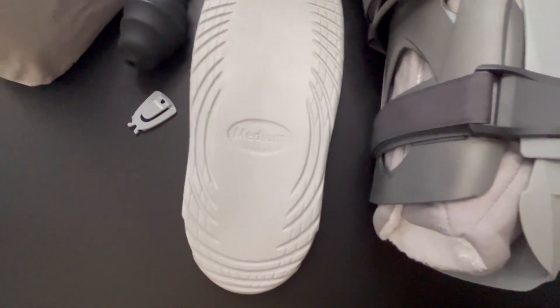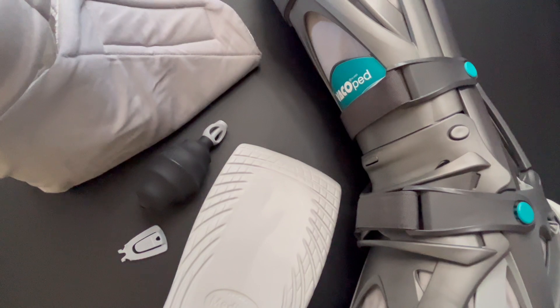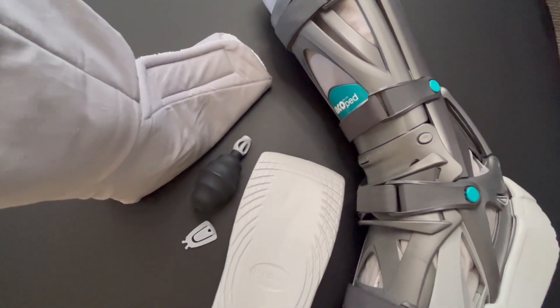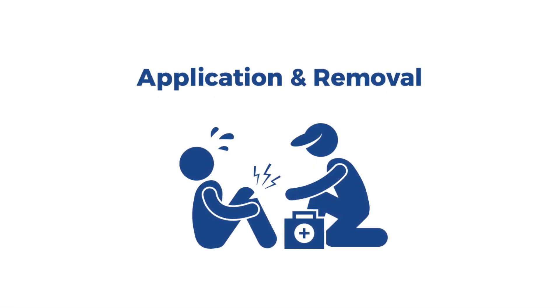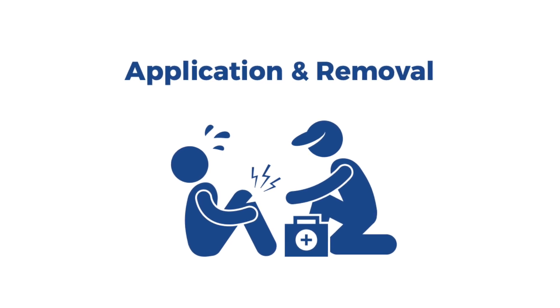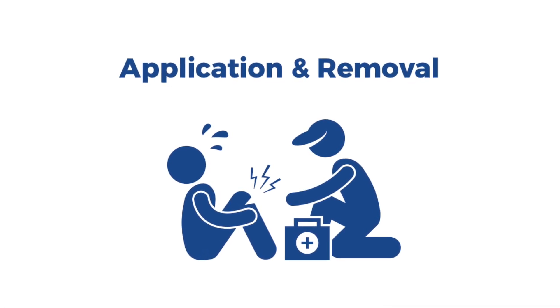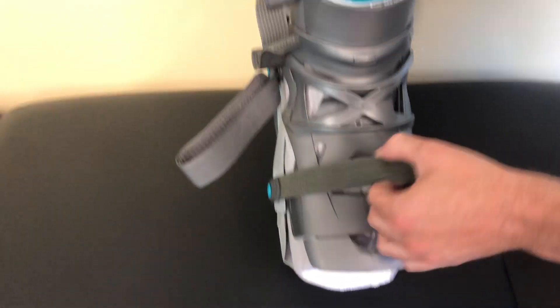You will be provided with a detailed protocol specific to your recovery. Please refer to your protocol for a full length of use and any additional restrictions. The Vacoped boot is universal for the right and left side and will be appropriately sized for you at the time of your initial fitting. To apply, first unlace all four straps, remove the front panel, and remove the liner.